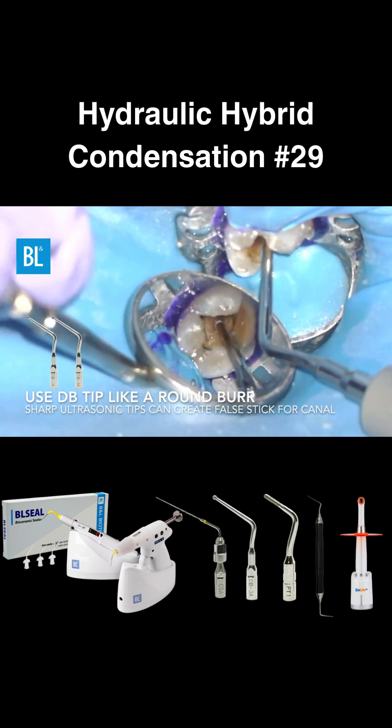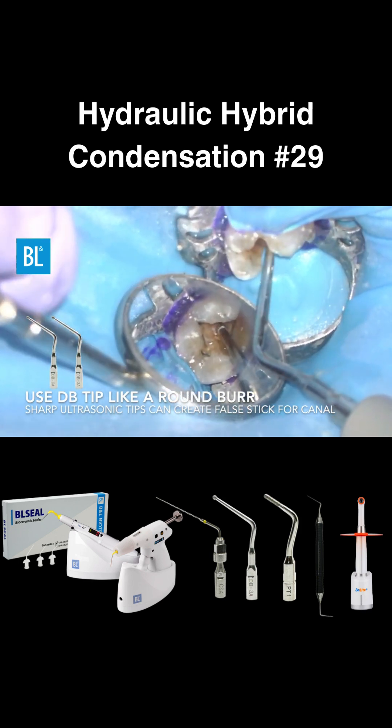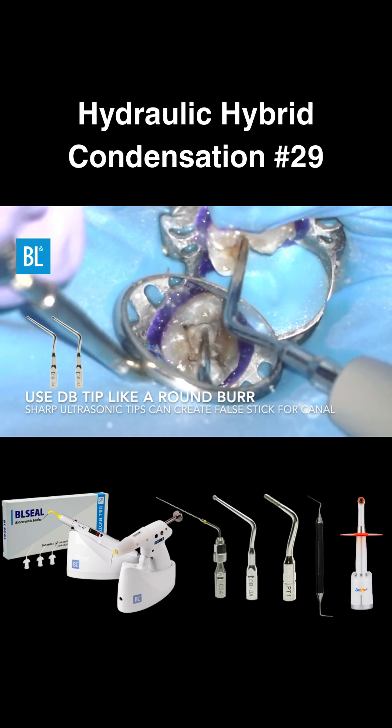Use a diamond ball tip, also known as a DB tip, to safely uncover the canal without risking perforation.